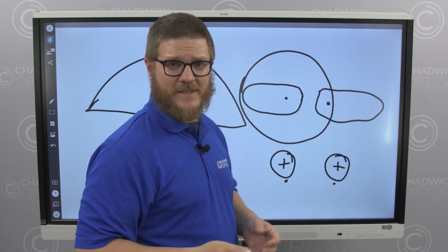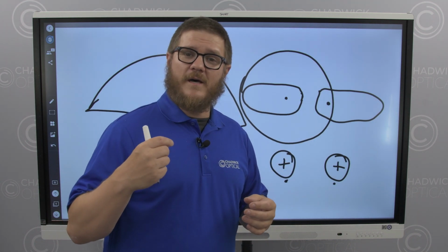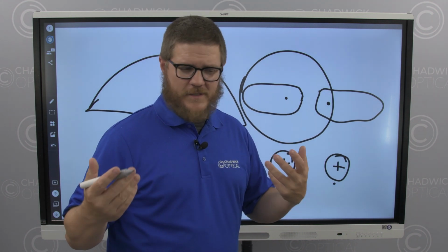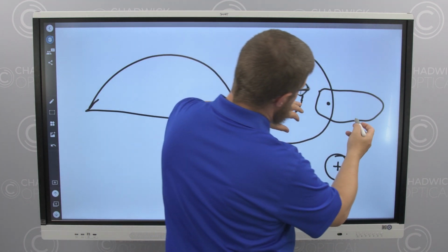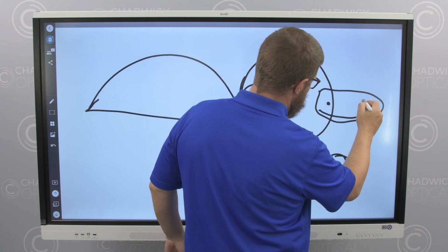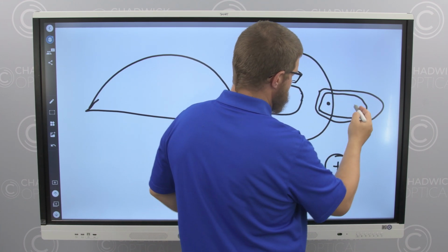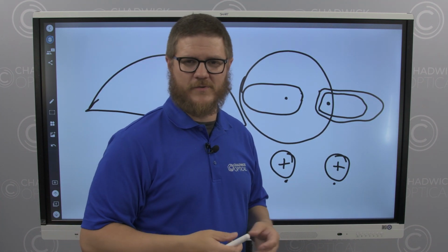So there's numerous reasons to not do the full wrap frame, but there are some neat modifiers. For instance, there's frames that have an RX rim. So rather than having the entire lens, you would have a rim inside the lens that then allows it to be a higher plus and make the higher plus look a little bit better.